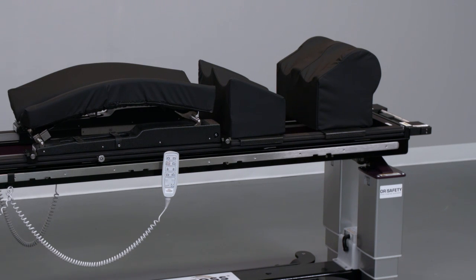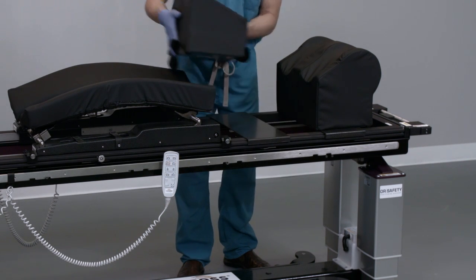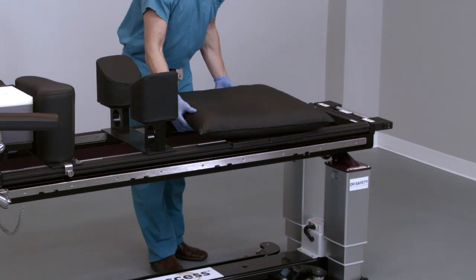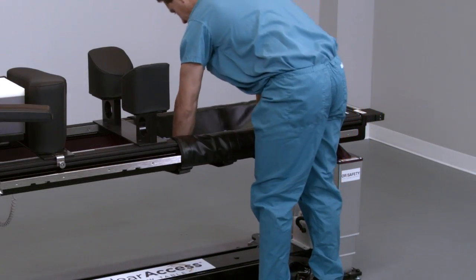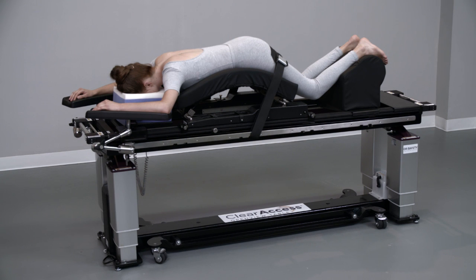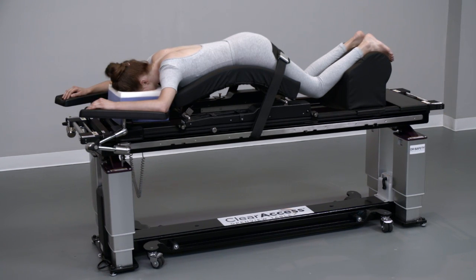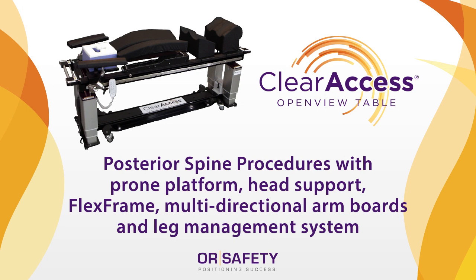Surgeon preference or certain posterior procedures may require alternative leg management options. For a flat lower-leg surface, remove the thigh pad and ankle rest, push the carbon fiber supports together and cover with a pillow or gel roll. If preferred, the carbon fiber supports can be removed and a sling installed onto the prone platform. Once the patient has been positioned on the table, use patient restraint straps to secure the patient before draping and preparation for surgery. Adjust the flex frame and arm boards as necessary for patient comfort and to minimize the risk of pressure marks. Please consult the Clear Access instructions for use with any further questions.